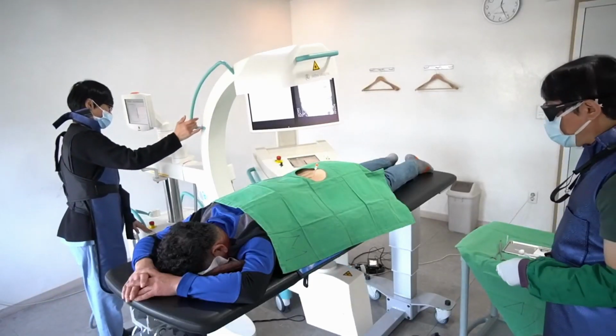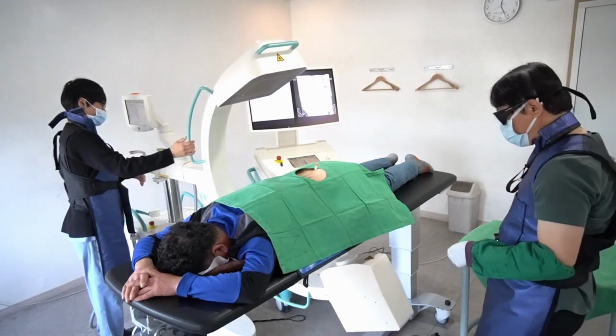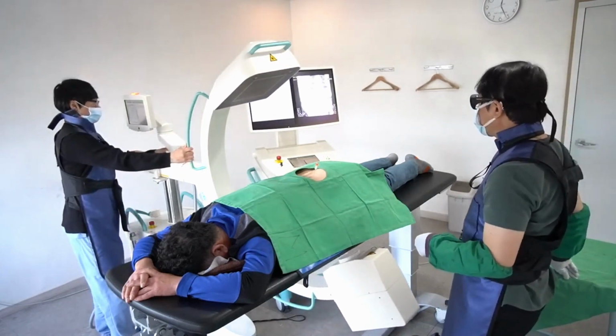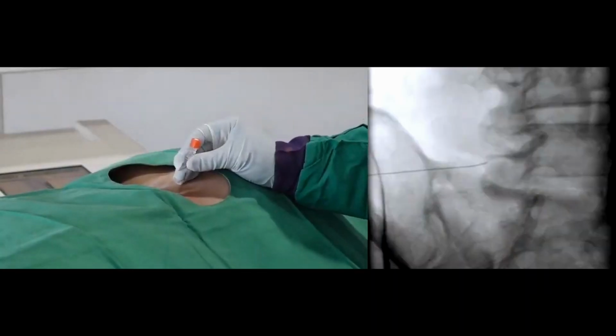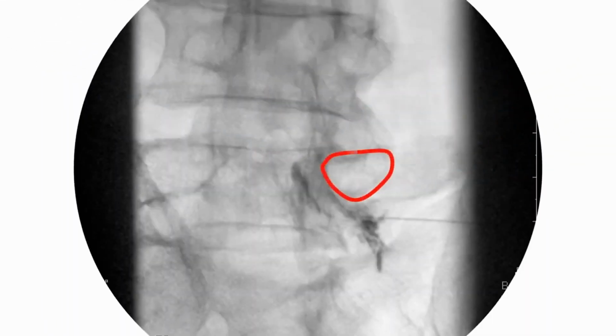For double confirmation, I'll turn the C-arm to the contralateral oblique position. I'll rotate the C-arm to the maximum extent possible to visualize a clear profile of the pedicle's cut section. Remember to keep in mind the pedicle's location and the nerve root pathway in the left contralateral oblique image. Notice the filling defect of the L4 nerve root as it passes along the pedicle's medial border. Consequently, the nerve root will pass beneath the pedicle.